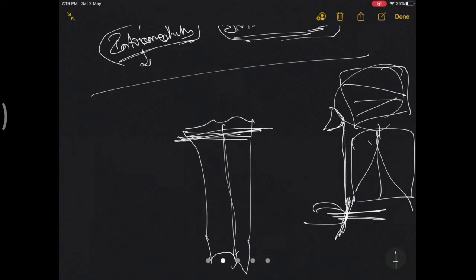And in cases of PS, it is said that you will take a cut which is almost 0 degrees, because the effective use of the cam post is best when it is parallel.